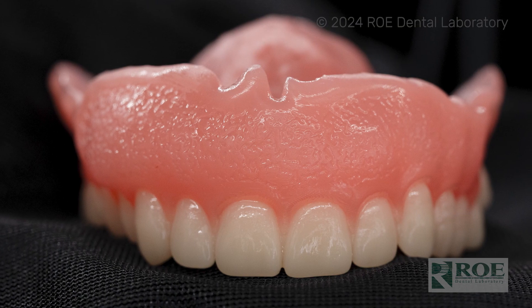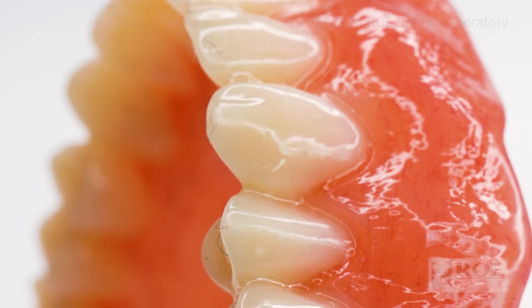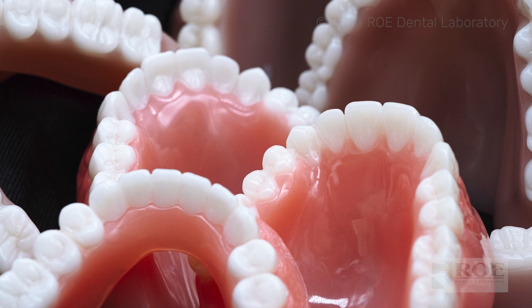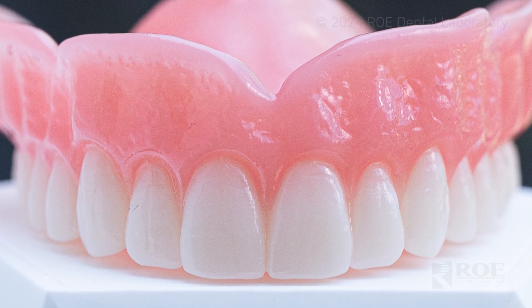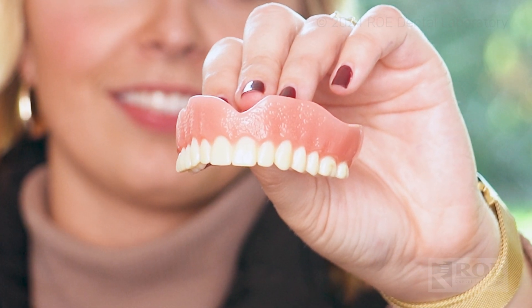Our second option when it comes to printed dentures is our lucitone printed base with milled teeth — same great base, but a little more of a premium experience. You're going to have more characterization — I like to call it the ombre to the teeth — where you see that incisal third shading, the gingival third shading, those little characteristics and quirks that we like to see with patients who are more aesthetically driven.